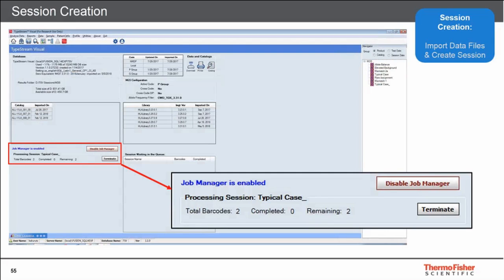When the session is finished processing, the user is ready to take a look at the data. Importantly, if you have a run of 48 samples, the user does not have to wait until all 48 samples have finished processing. As soon as the first sample in a session has finished processing, the user has access to that sample and that session. You have access to the session in real time as each sample finishes processing — you do not have to wait until the entire session is completed.